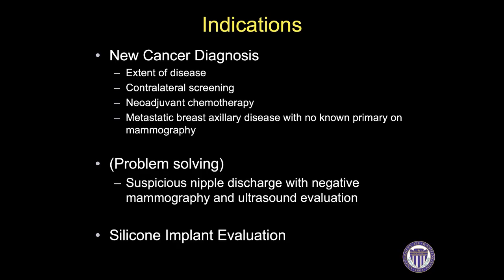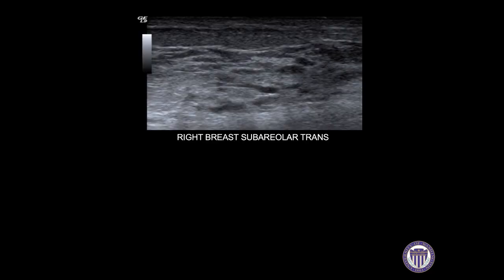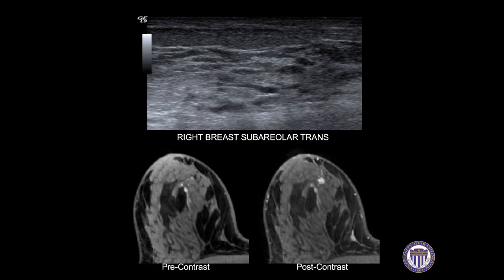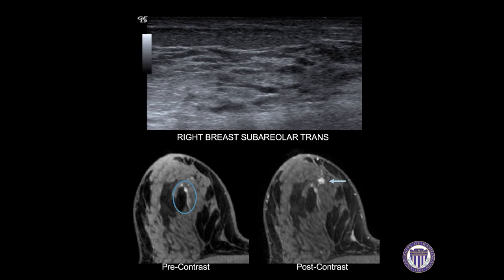There are also special clinical scenarios, such as suspicious nipple discharge with normal findings on diagnostic mammography and ultrasound, where breast MRI can be used for problem solving. In a 46-year-old woman with spontaneous bloody right nipple discharge, both her ultrasound and mammogram were negative. MRI showed intrinsic T1 hyperintensity in the ducts, and post-contrast imaging revealed a round enhancing mass. Biopsy revealed an intraductal papilloma, which was the cause of her suspicious nipple discharge.